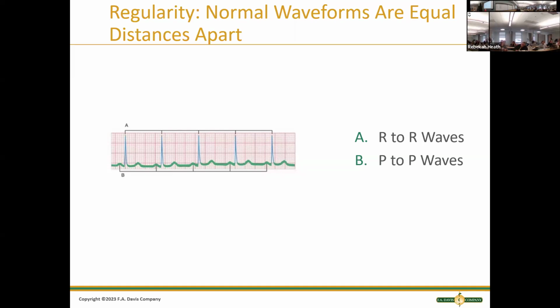Okay, how are we feeling about the atrial flutter? It's normal. Once you've done the atrial flutter, I want you to go to the one down below it and look at the atrial fib and measure that one.